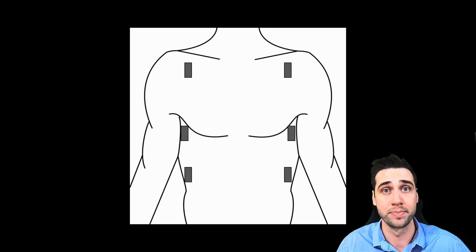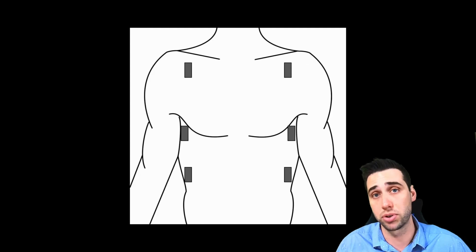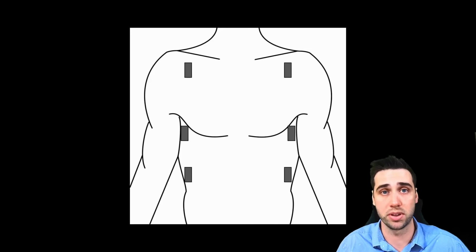This is what you would see if there was a pleural effusion above the diaphragm. Some people do a lot more zones, but this is basically what we do in RED for lung scanning: 3 zones on each side, right below the clavicle, the axilla, and then just above the diaphragm. You can look up different protocols if you want to have better sensitivity and specificity, looking for different pathology. We'll discuss that a little more in the pathology lecture.